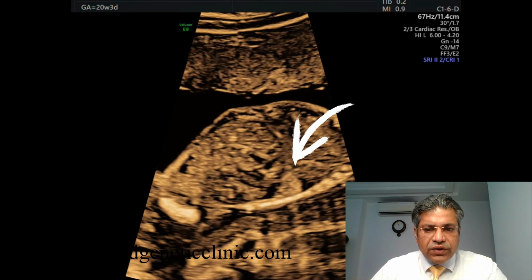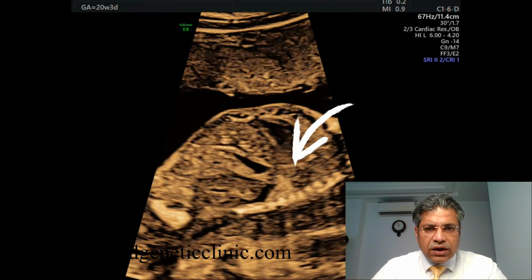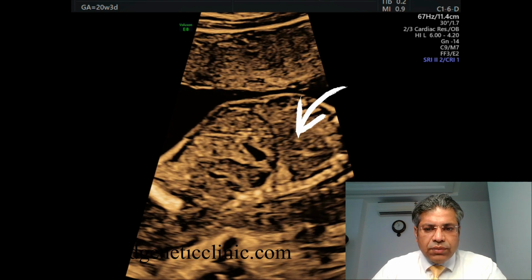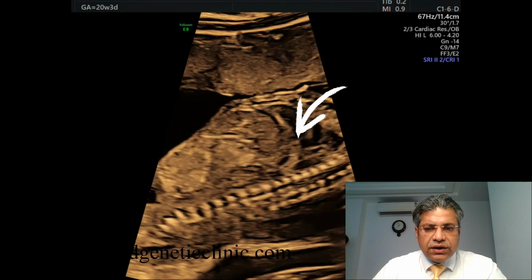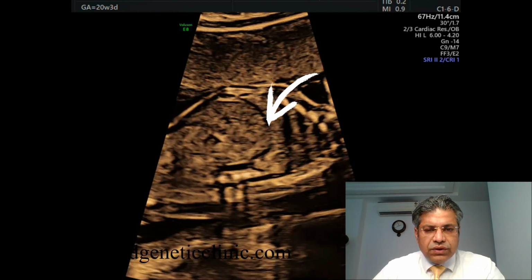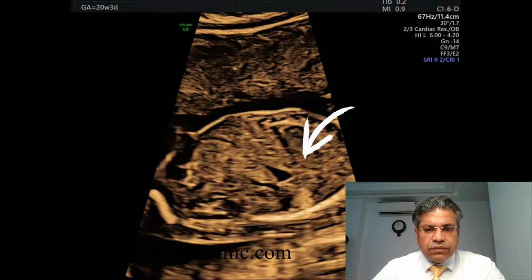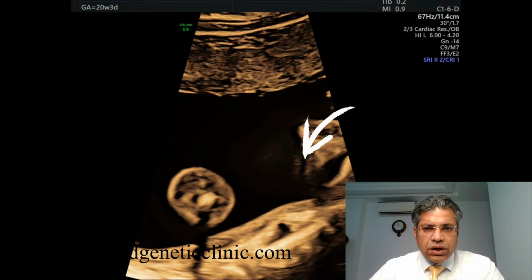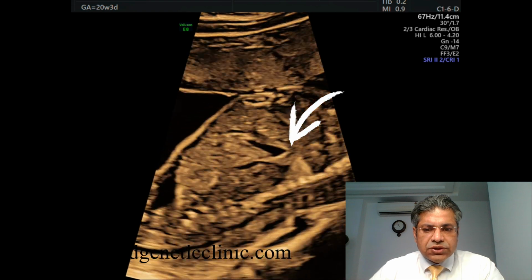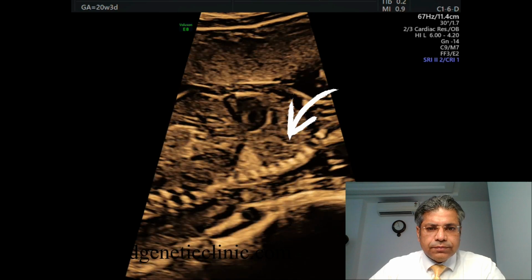So how do we identify them? By doing a CVR ratio. When the CVR ratio is greater than our cutoff, they are more prone to create hydrops and a mass effect, as a matter of fact, right? But this is an incidental finding. We identify it as a hamartomatous lesion, benign in nature, which can grow from 18 to 26 to 28 weeks, then it plateaus, and in 10% of the cases it might even regress. Okay, so this is just a normal finding.